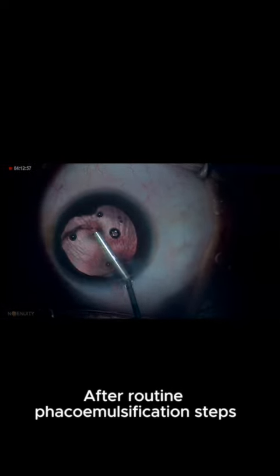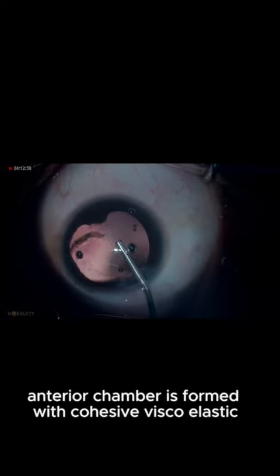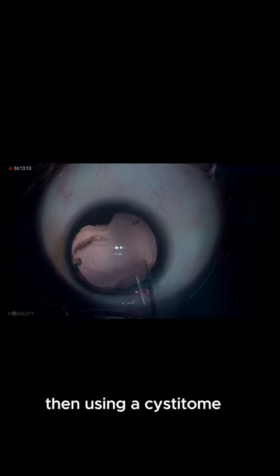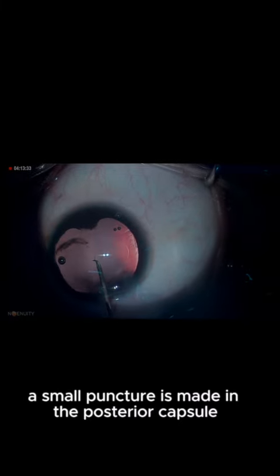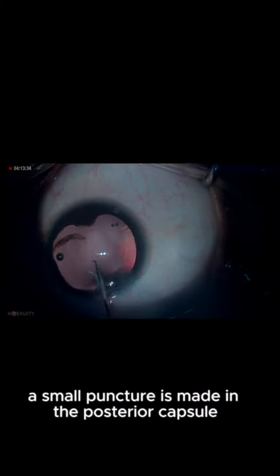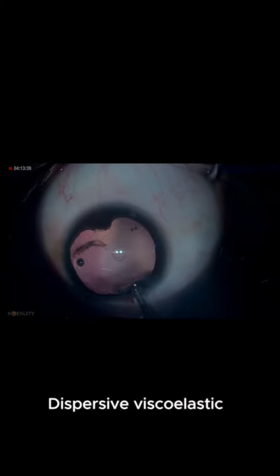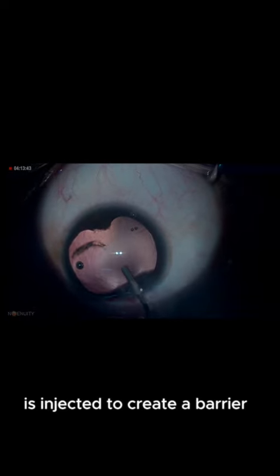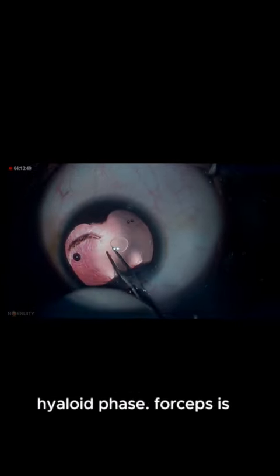After routine phacoemulsification steps, the anterior chamber is formed with cohesive viscoelastic. Then, using a cystitome, a small puncture is made in the posterior capsule. Dispersive viscoelastic is injected to create a barrier between the capsule and the anterior hyaloid face.